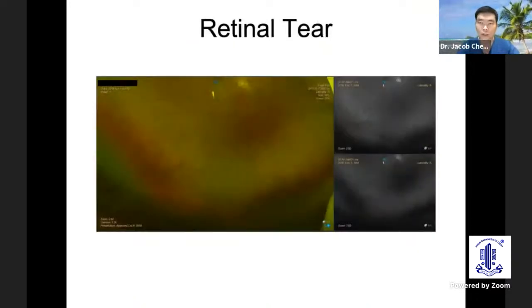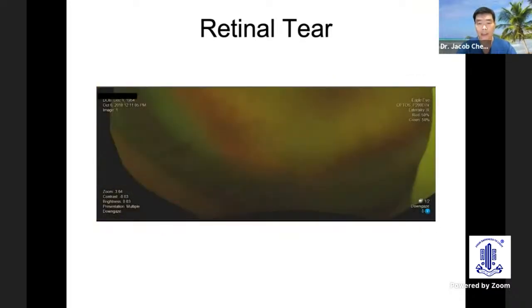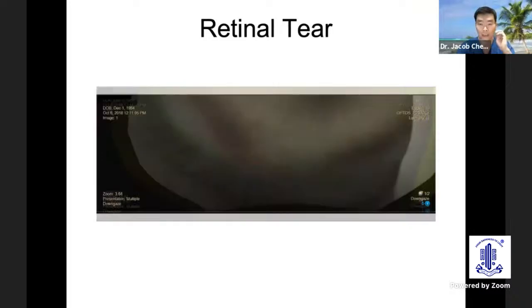It's not easy to document a peripheral retinal tear with just a normal fundus photograph. Here you can see a very peripheral retinal tear which may not be easily picked up, but is easily picked up on the Optos ultra-wide field. Here highlighted within the red circle. And again, over here on a magnified view within the red circle would be a very peripheral retinal tear.